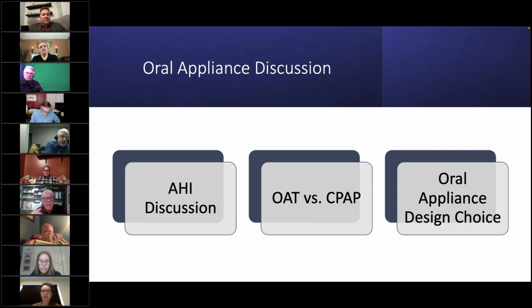However, for the vast majority of other patients, I prefer that connected appliance because I know I've eliminated the potential created by opening, and I also know how flexible this appliance can be. I'll choose an appliance almost regularly that is Thermacryl or Thermaline lined, and the reason is its incredible flexibility. Once I use another liner and I've lost the tension, I've lost the tension.